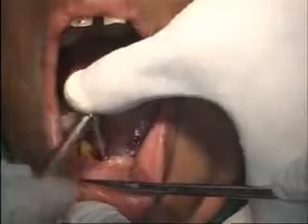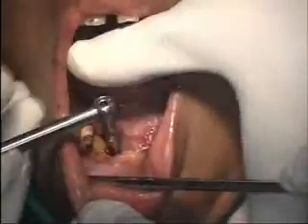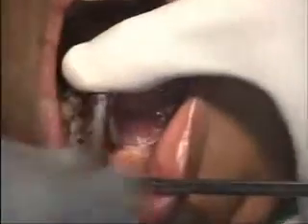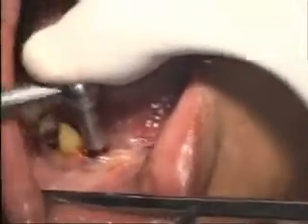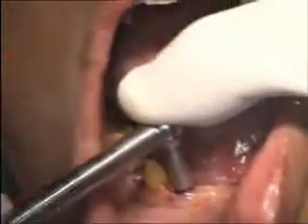See — now it has got the threads. Now it goes in. Insert the implant. Vicky, we have to do the power rotor which is there. Now my implant insertion is complete. The transmission aid has touched the gums. I will take it out. That's my implant.